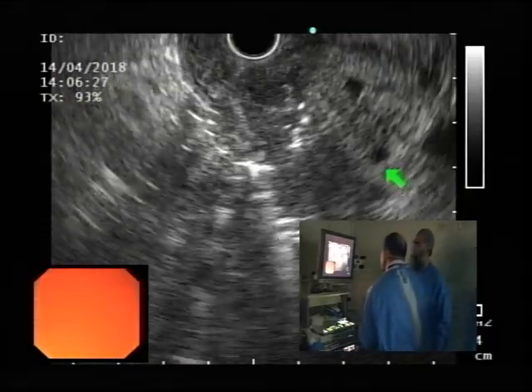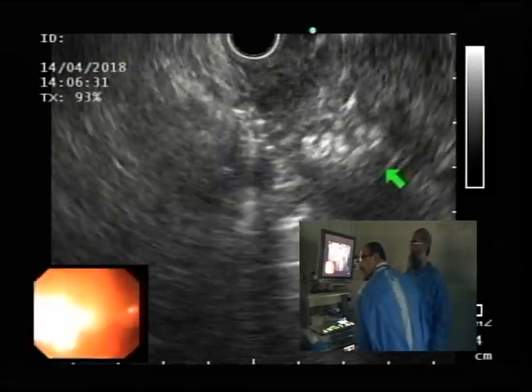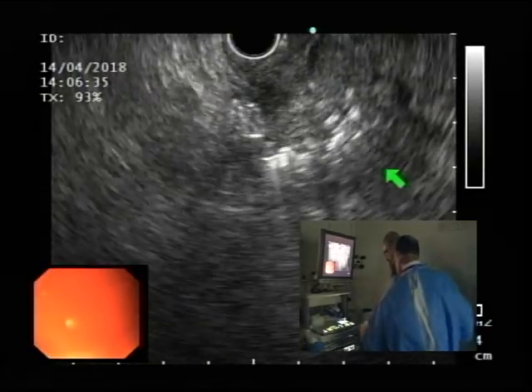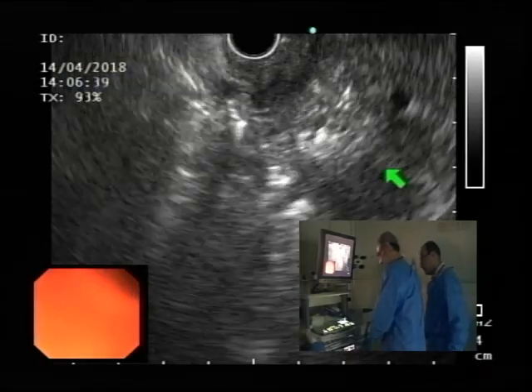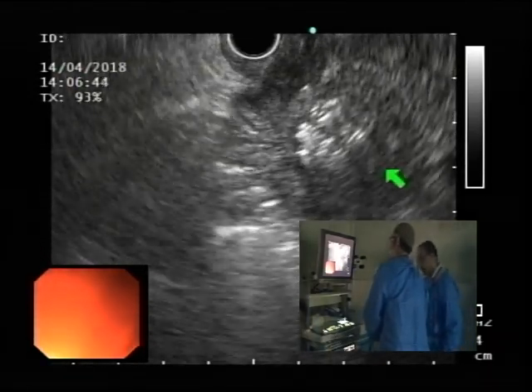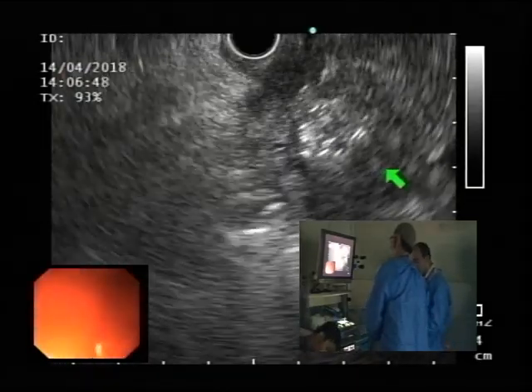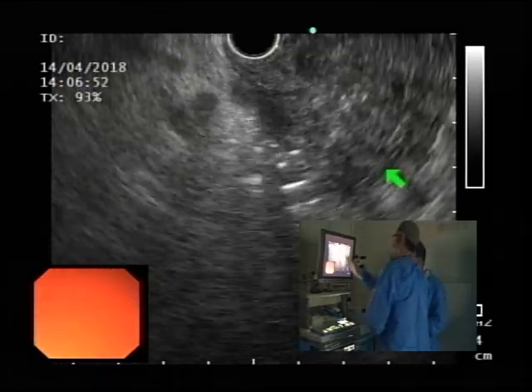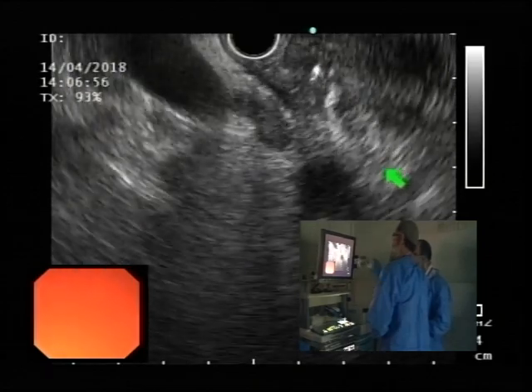So this maneuver, because this was not the ideal lesion for the second portion, try this. And you'll have to do a fair amount of thumb down. And now just, yeah. Pull back. And go counter with your wrist. There you go. And then pull back just to bring it into the center. Pull back some more. Now go clockwise and counter.